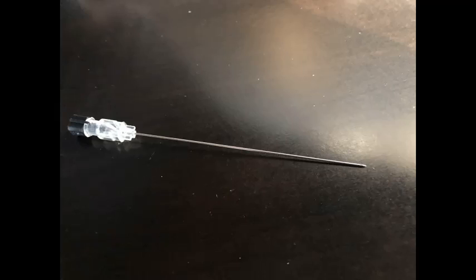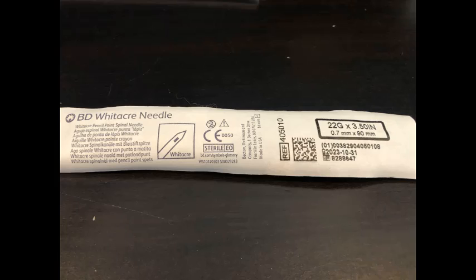Of course, a pro is decreased chance of spinal headaches. As IR docs, we are really familiar with beveled needles and use them all the time, so there can be a bit of a learning curve with the pencil tip needles. I will say that I asked my partner to use one. He basically couldn't get it through the skin and immediately proclaimed it a piece of junk. So just a warning, they can take some time getting used to.